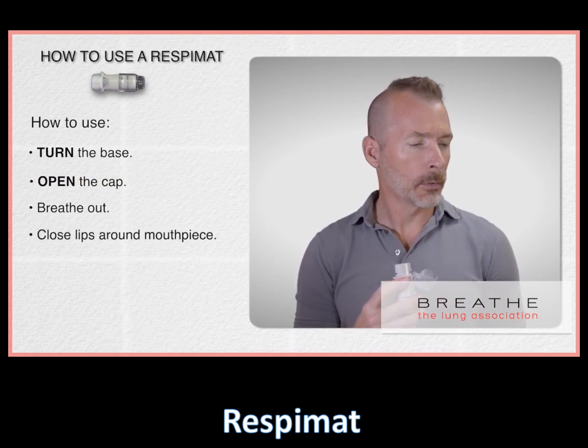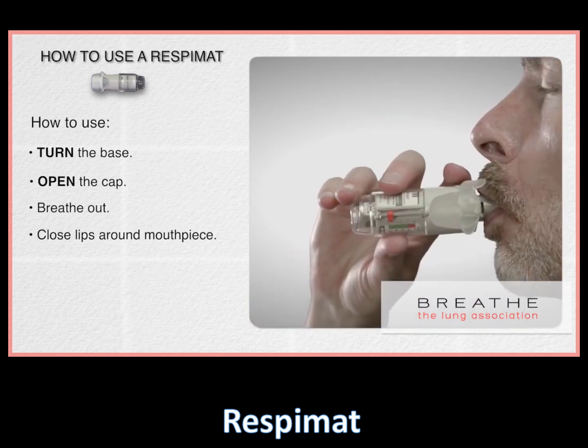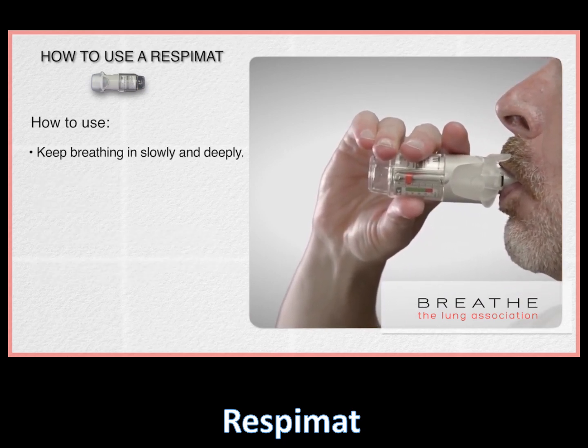Close your lips around the mouthpiece without covering the air vents. Point the inhaler towards the back of the throat. While taking in a slow, deep breath, press the dose release button and continue to breathe in slowly.